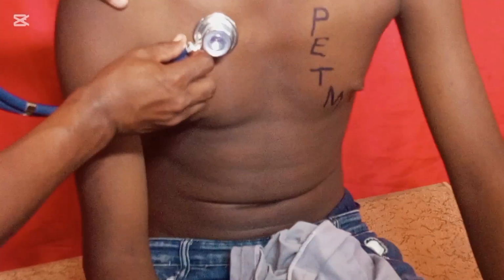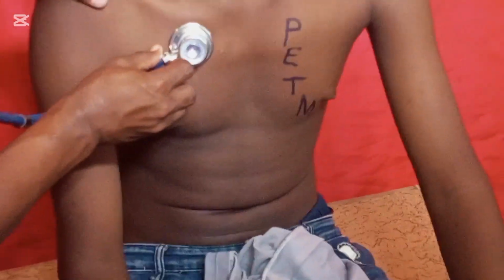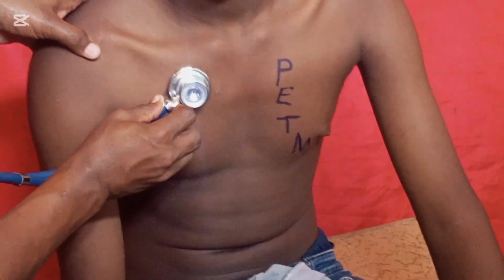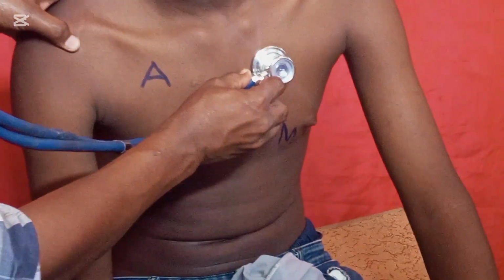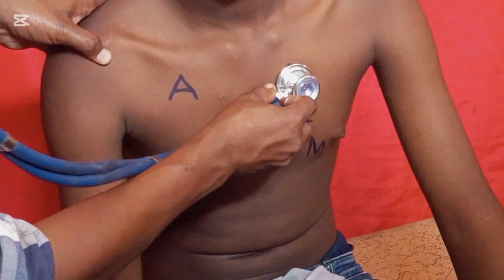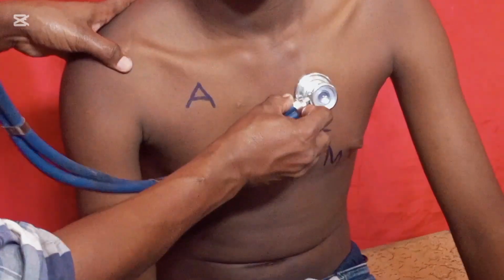You will hear a sound that is lub-dub, lub-dub, lub-dub. Then you move into the second intercostal space on the left side of the sternum. Here is where we find the pulmonic valve.